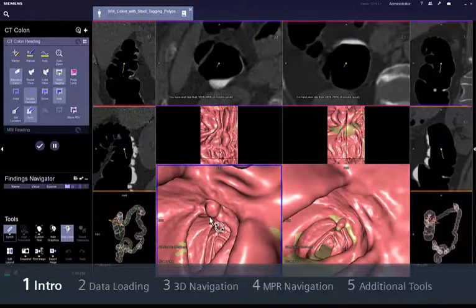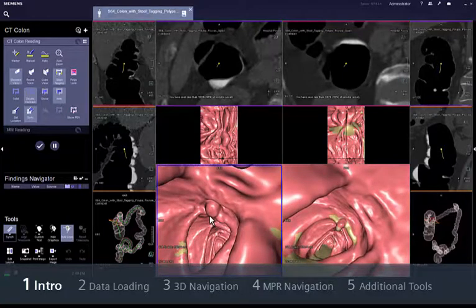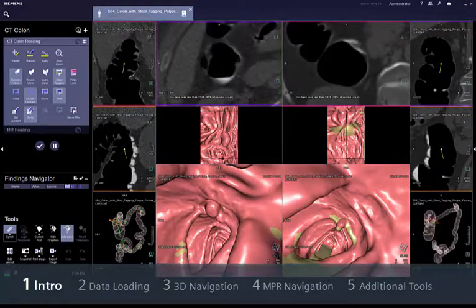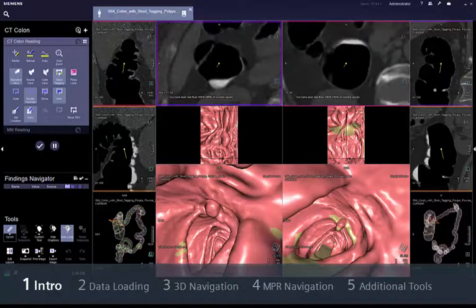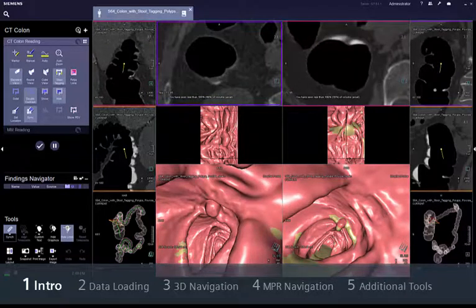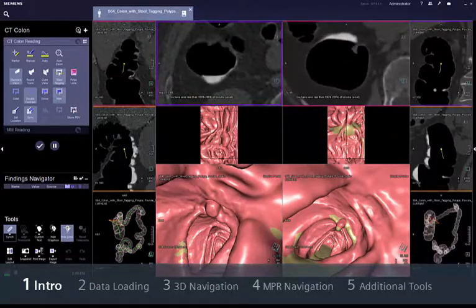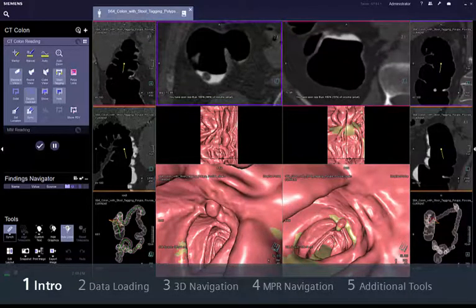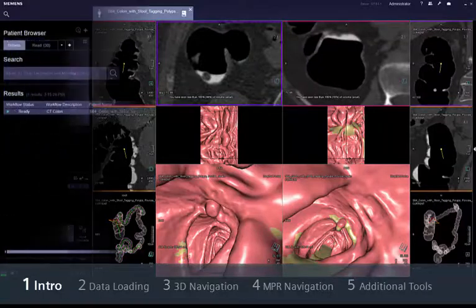Syngovia CT colon workflow provides guidance to accelerate your reading process efficiently and accurately. This movie will show you how to evaluate CT colon data sets using Syngovia.